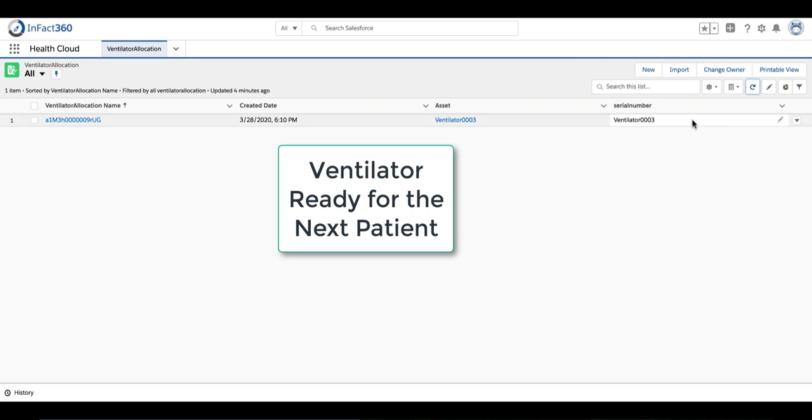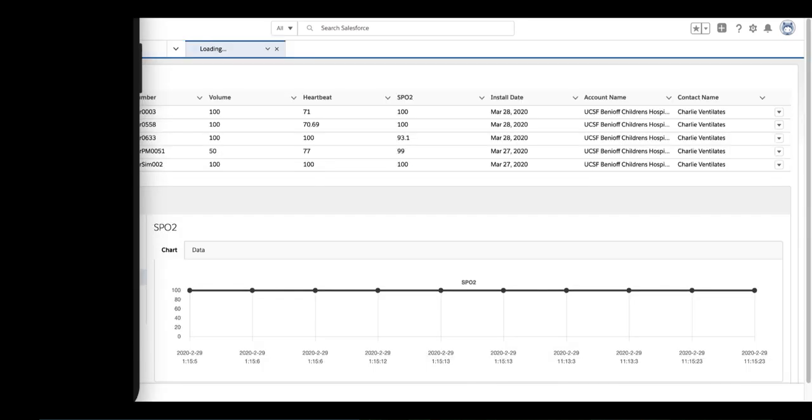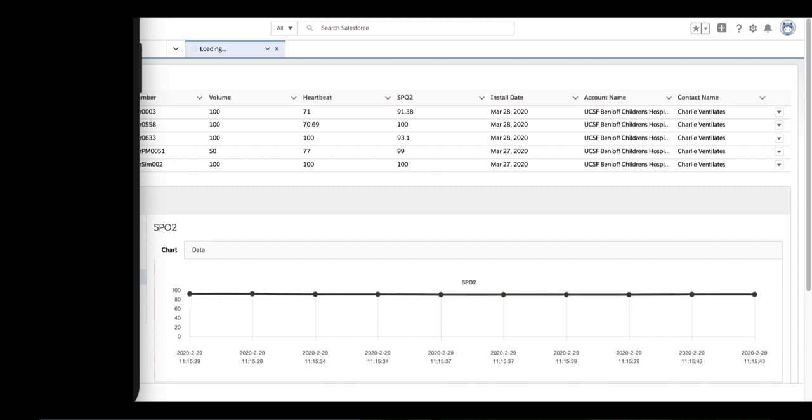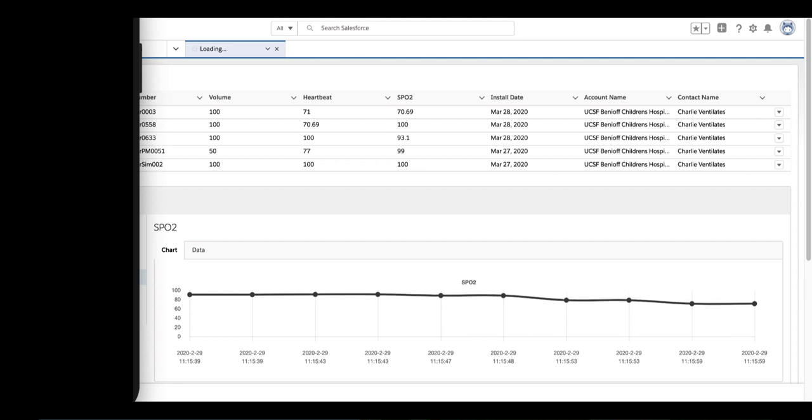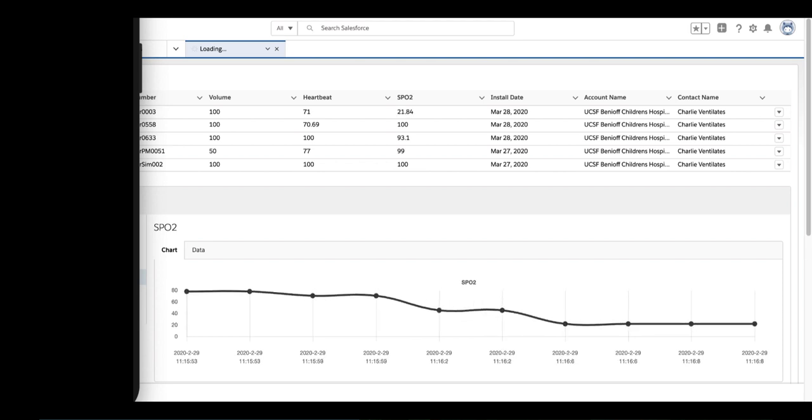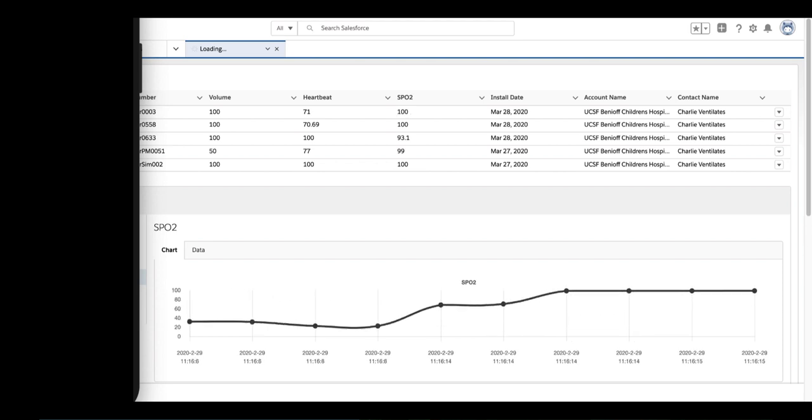There's also a Salesforce Lightning component that monitors all the sensors attached to the equipment and the patient. You can see here that the SPO2 levels are falling and rising.